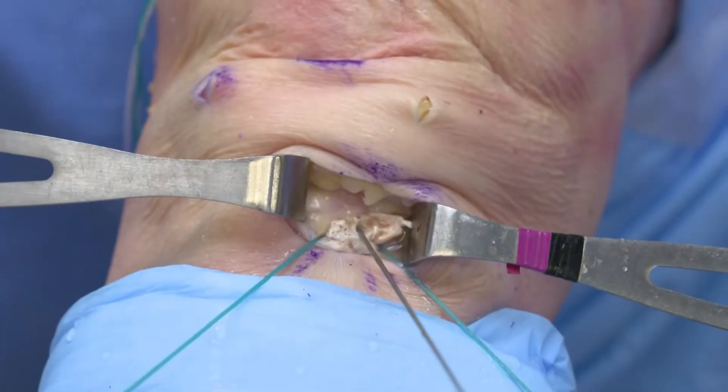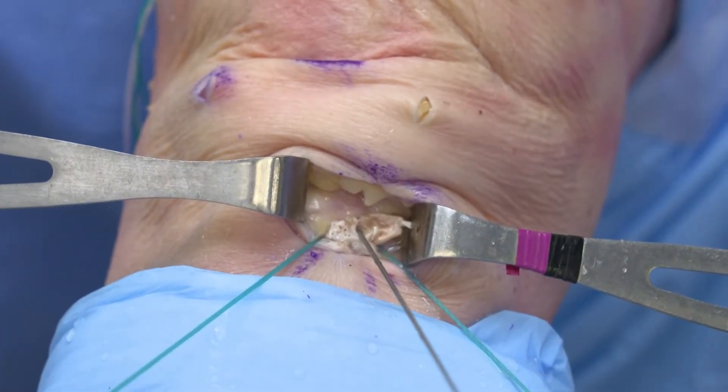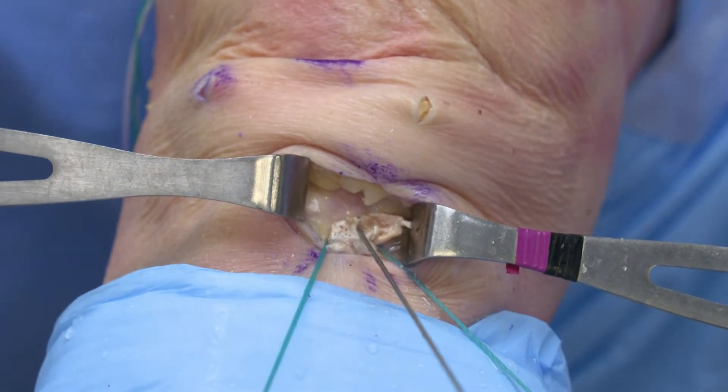Okay, so now we're gonna secure the graft on the tibial side with the intrafix. Split the two grafts, that should do it.